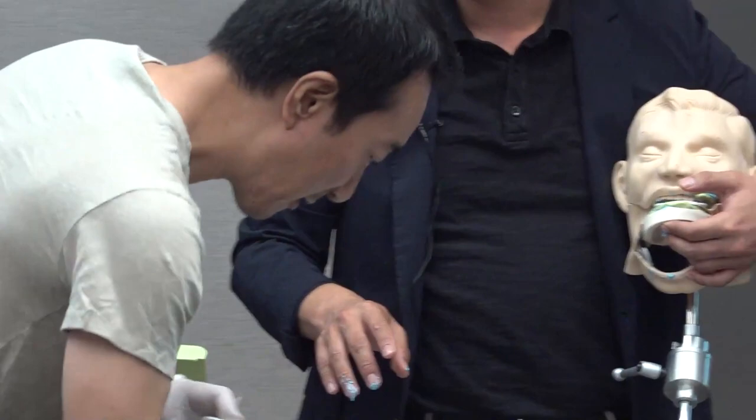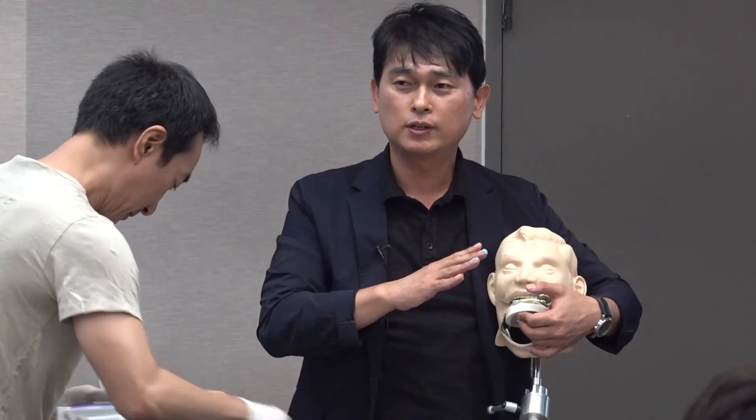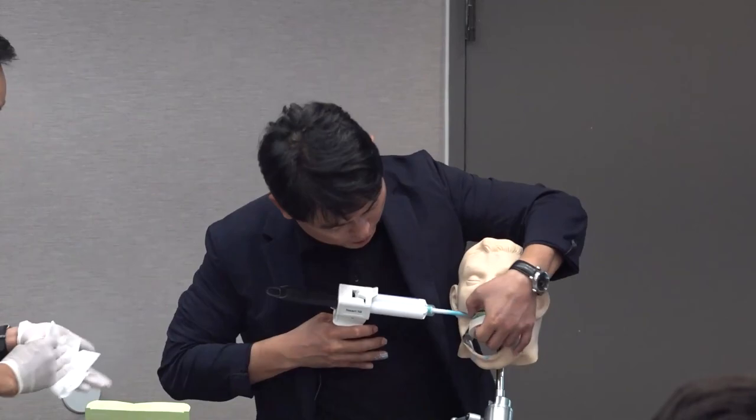If you make a temporary denture, this procedure will be simpler than the final procedure. After making the temporary denture, you can give a period for adaptation, and then through the wash impression. Do you know wash impression? Using the temporary denture, you can apply this silicone material and then bite. And then you can duplicate.